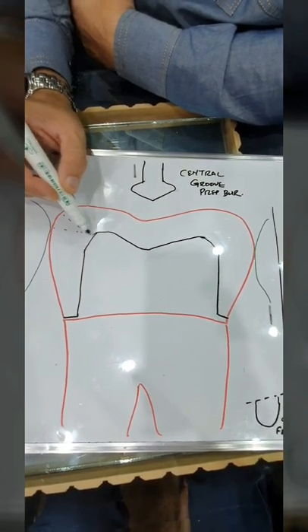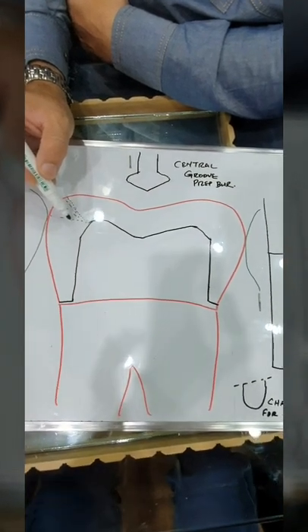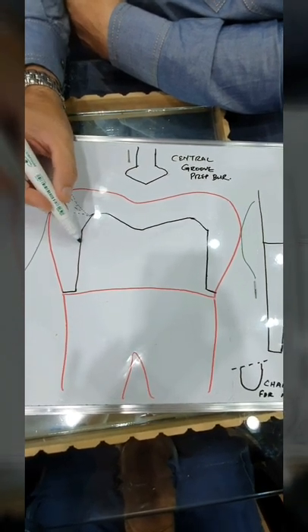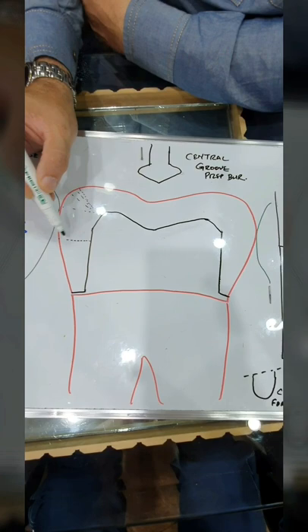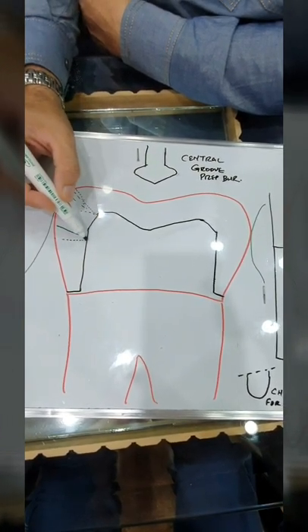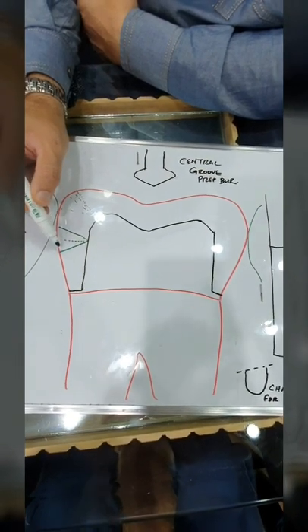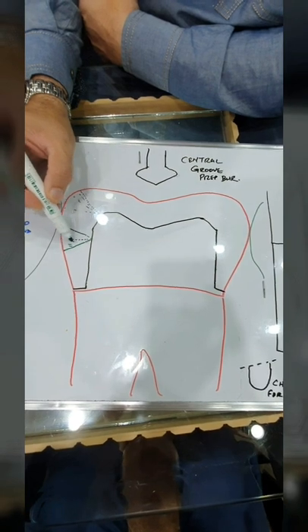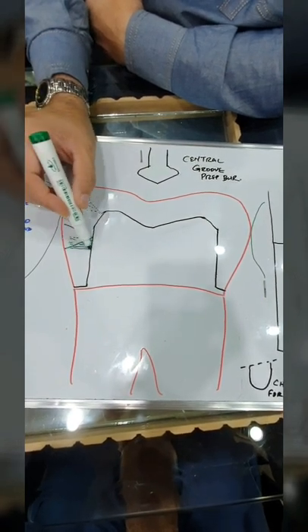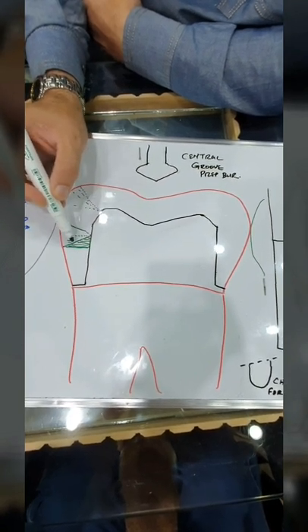So you have to exit the margin onto the tooth structure, at least according to the enamel rods, or a little bit more obtuse. Let's say the enamel rods are coming this way. Do not make the margin like that. If you want to make the margin, you can make it as such with an exaggerated obtuse angle. This would remove all of these enamel rods, and the enamel rods that are left here are still supported. So you can always err towards an obtuse angle.